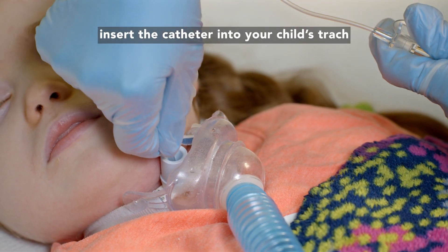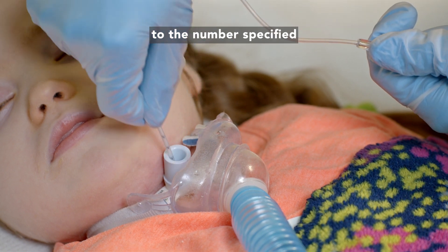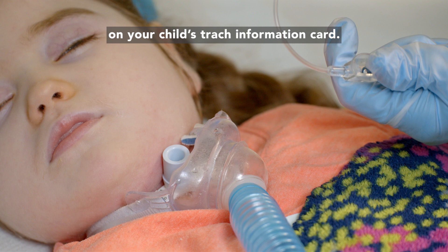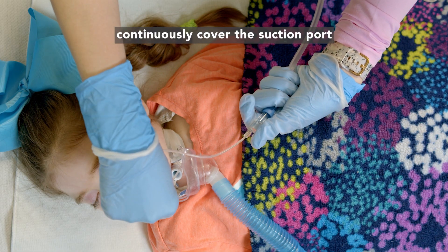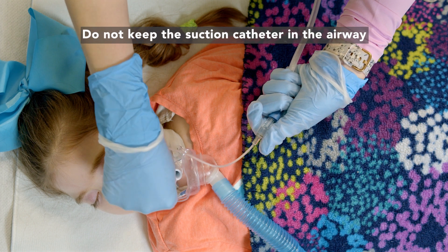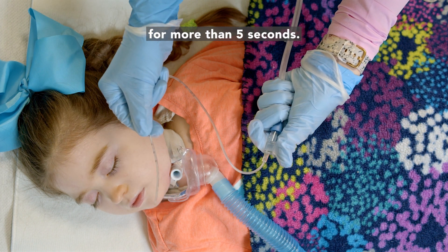Using your clean hand, insert the catheter into your child's trach to the number specified on your child's trach information card. With your dirty hand, continuously cover the suction port while withdrawing the catheter slowly. Do not keep the suction catheter in the airway for more than five seconds.